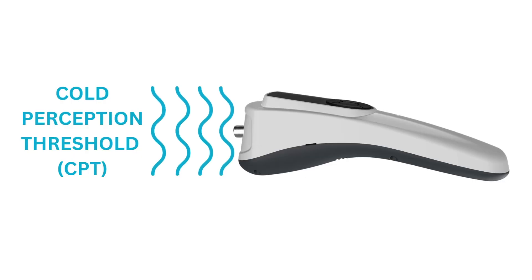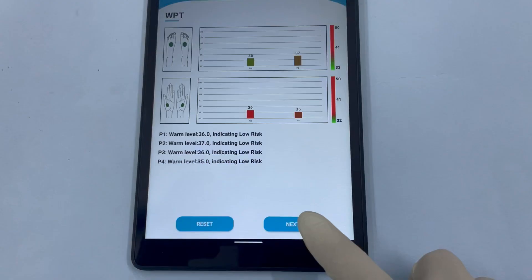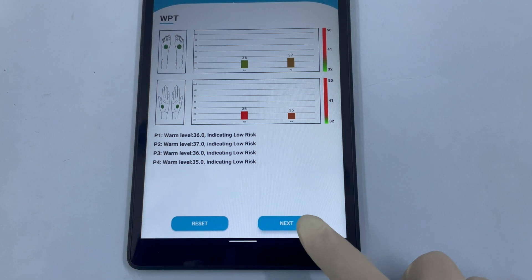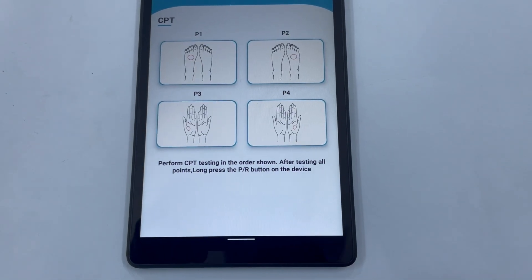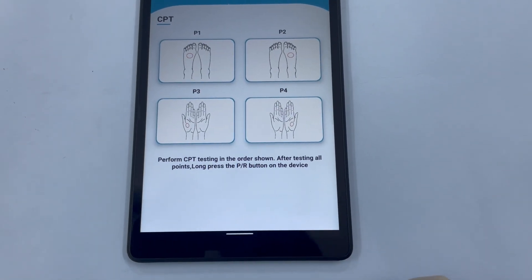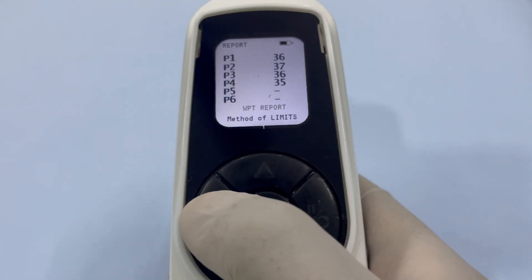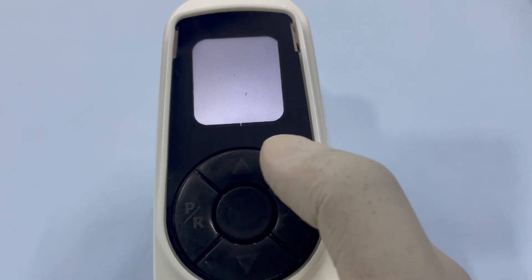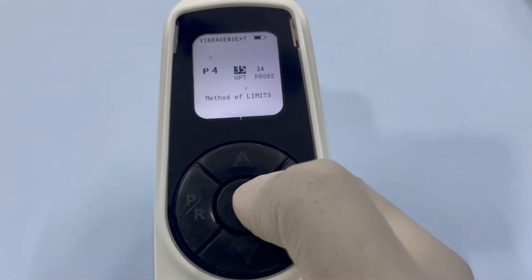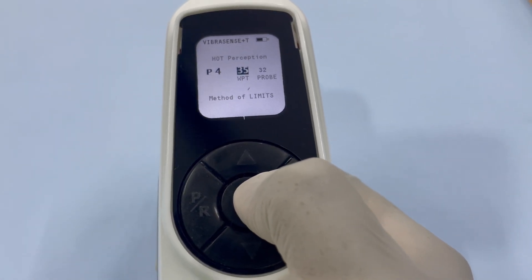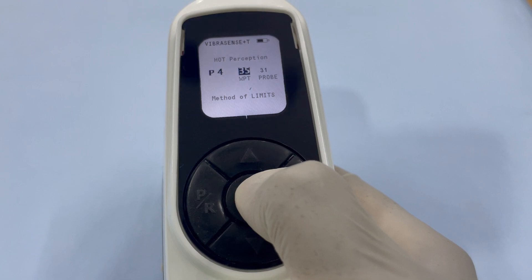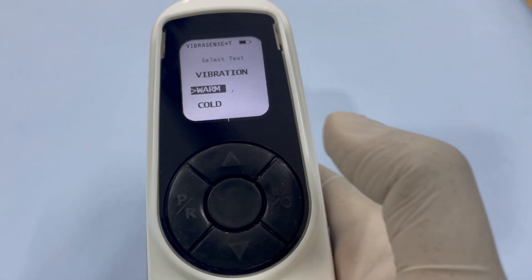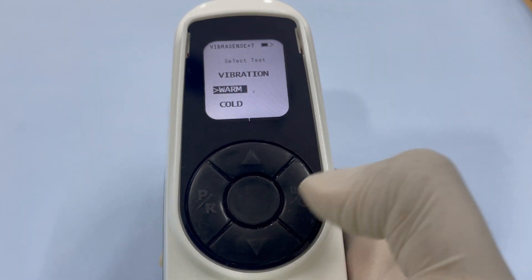Cold Perception Threshold test. Press the Next button below the report on the app screen to proceed to the next test screen. On the device, first press the PR button once, then long press the center button to return to the home screen.